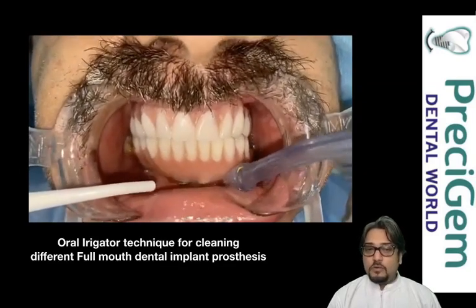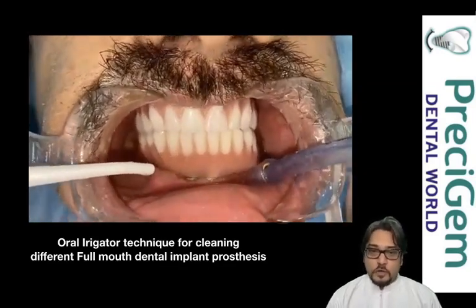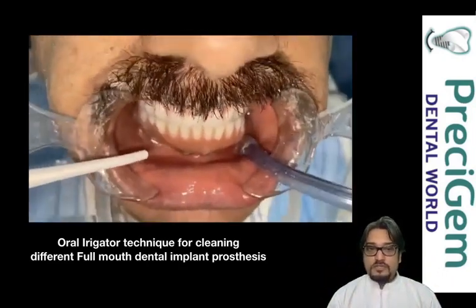The force with the manual oral irrigator is controlled by your hand. This is exactly FP3 prosthesis — we are focusing the water on the area between your gums and teeth, and that's where the cleaning is happening.